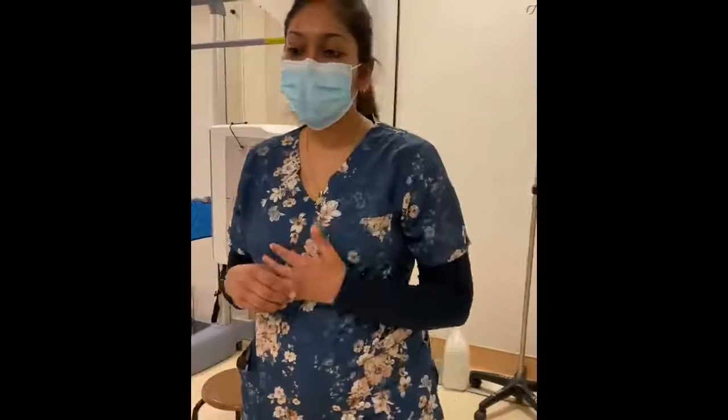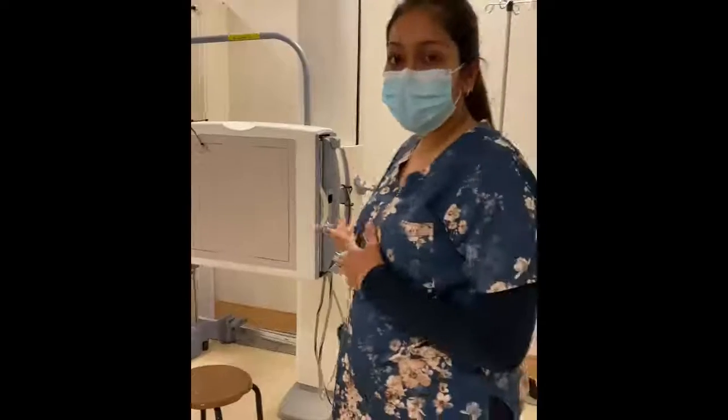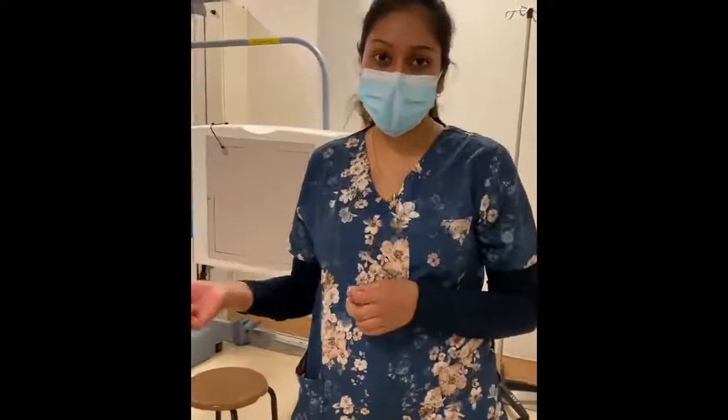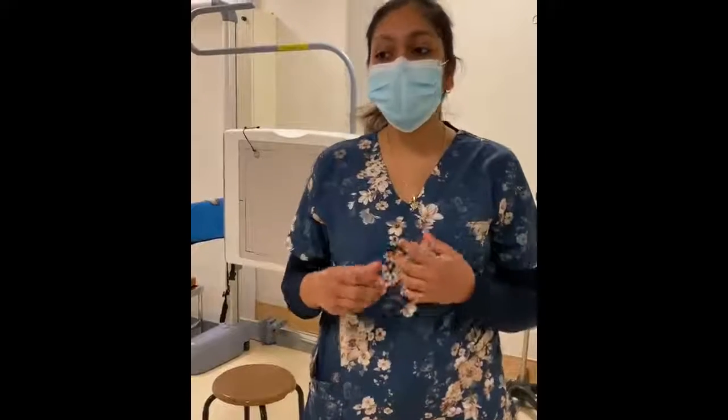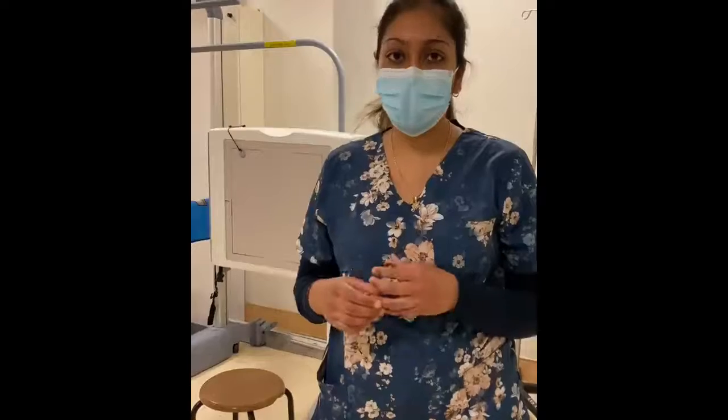In terms of setting up the room, we need to use a grid, and we also need to use an FFD that is 100 centimeters. In terms of your exposure factors, you could try using around 70 to 80 kV and maybe between 16 to 20 mAs.